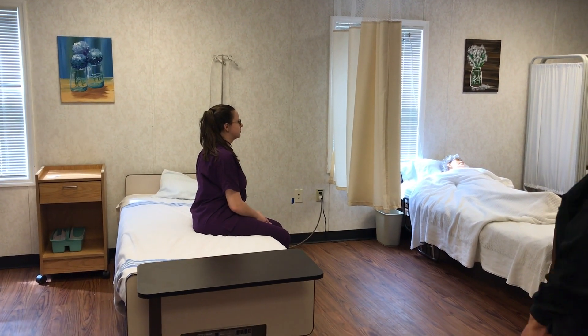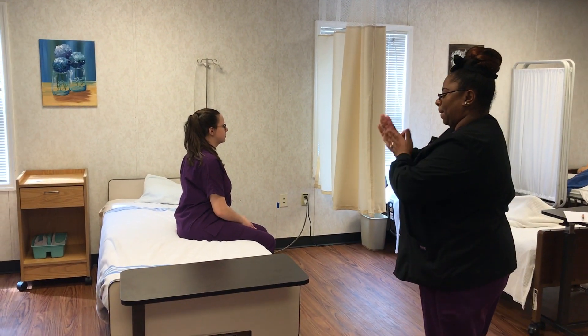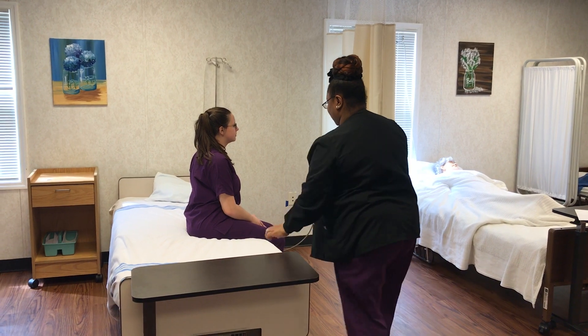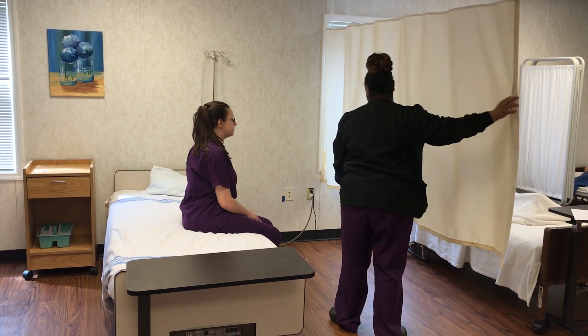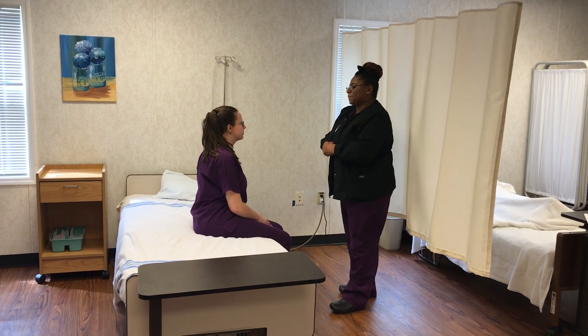This skill measures and records manual blood pressure. You'll wash your hands, knock on the door, check that the bed is locked and lowered, provide privacy, and address the client and explain the procedure.